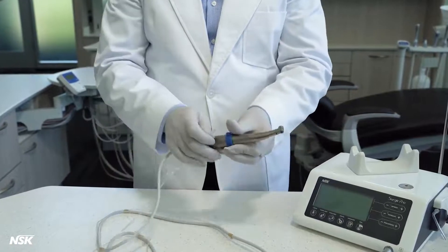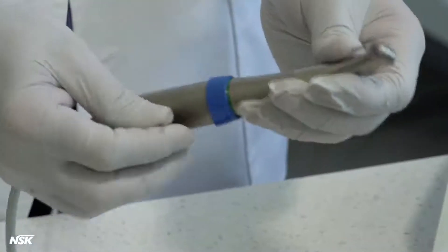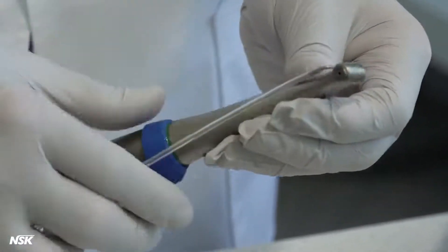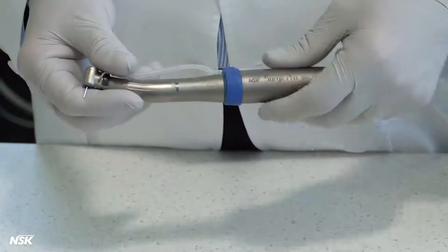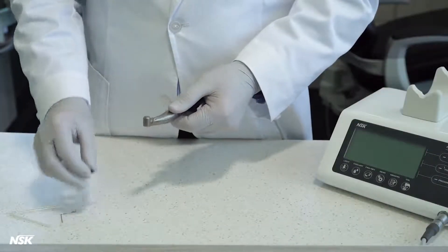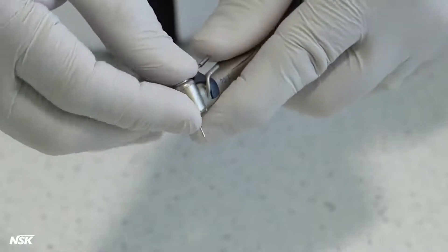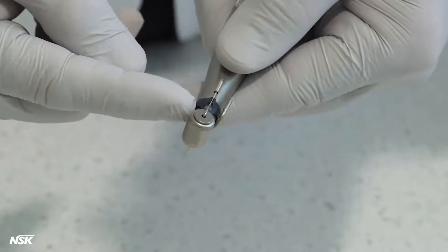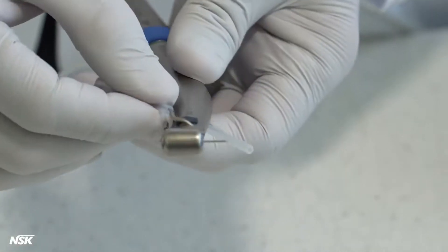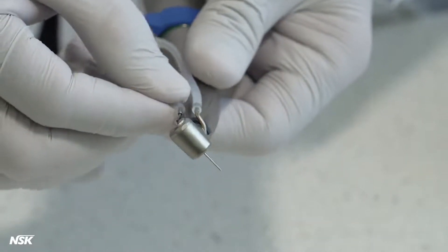There are two ways to connect the irrigation tube to the implant attachment, depending on the type of drill being used. Single external spray is very common, in which case connect the end of the irrigation tube directly to the external spray nozzle of the attachment. If you need dual irrigation, use the internal spray nozzle in addition to the Y connector. The internal spray nozzle is mounted on the neck of the attachment; using the black holder, with a slight push, it will click into place. Simply connect the Y connector to the end of the main irrigation tube, then connect one of the water supply tubes to the external spray nozzle, so the free end of the Y connector is connected to the internal spray nozzle.